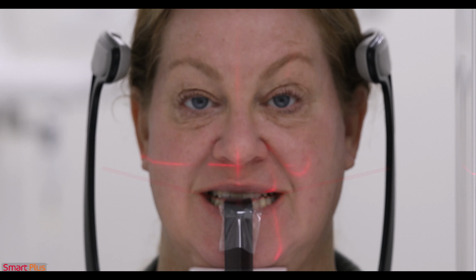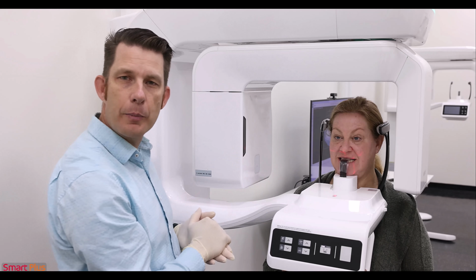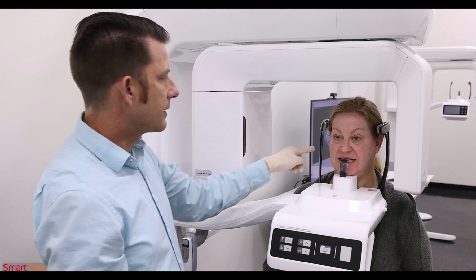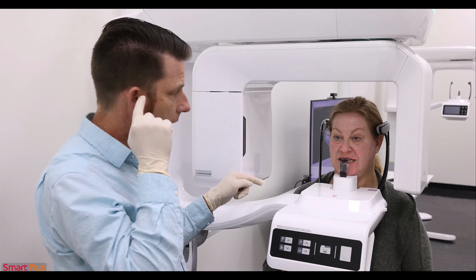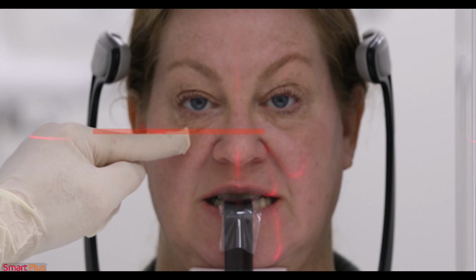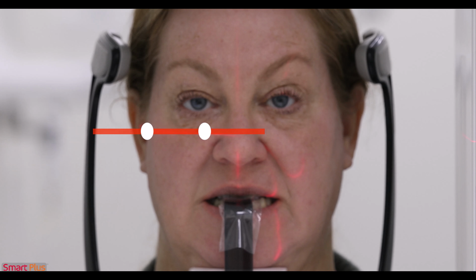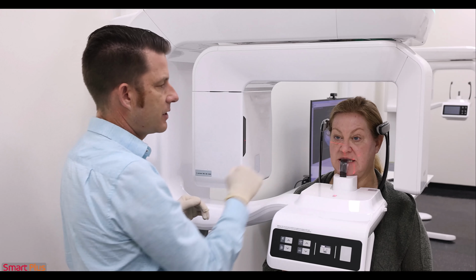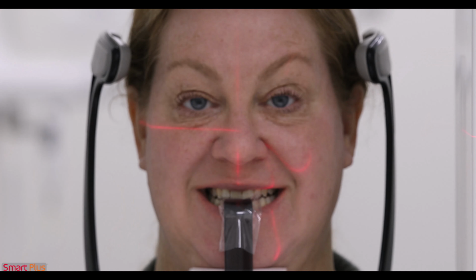We also have our Frankfurt horizontal beam shining on the right side of the patient's face. This is a reference you can use for that natural head position. I'm going to bring this up and it's right at the top of the tragus or the top of the ear canal. And I'm going to run it right through the infraorbital notch of the eye. That is another reference where we can see, and if she smiles, I can see her occlusion is slightly tipped down at about a 10-degree angle.